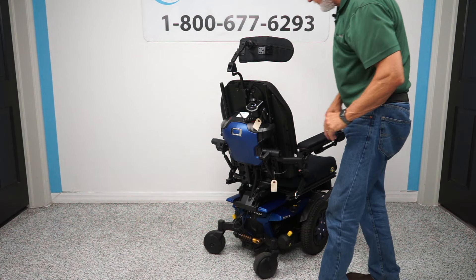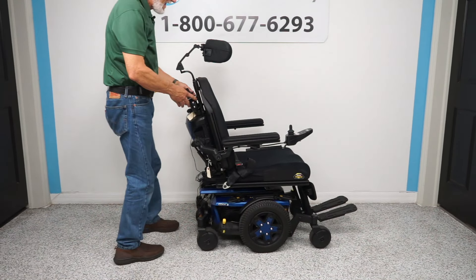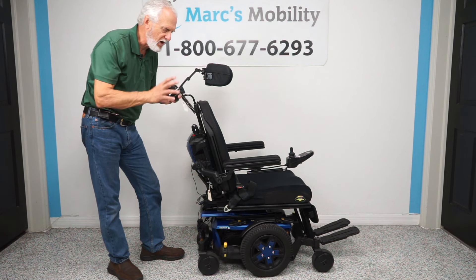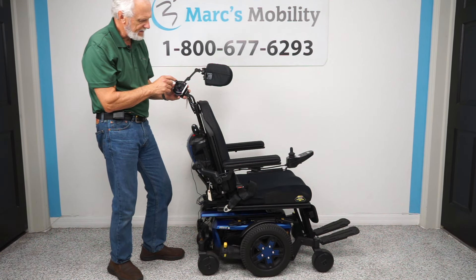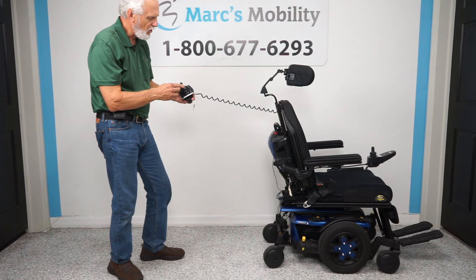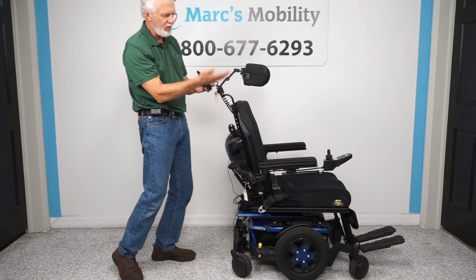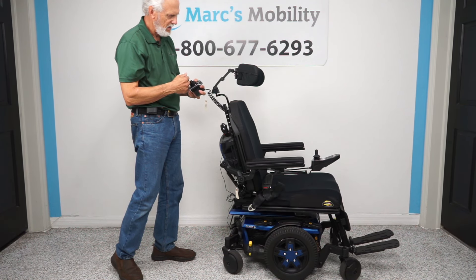This chair also has an attendant control in the back. If you have a loved one that you need to push — in a nursing home, on carpet, up a ramp — but they cannot drive themselves, you just switch it over and now you can drive the chair right from the back handle. You can turn, you can do anything right from there.